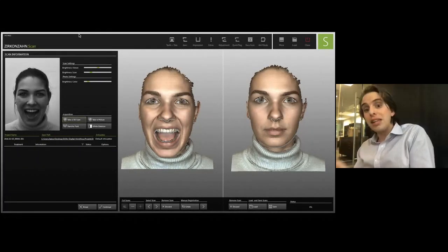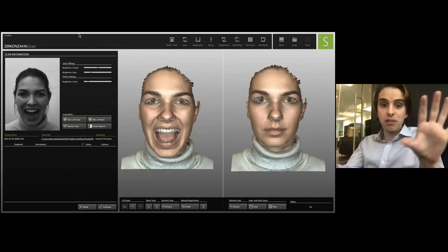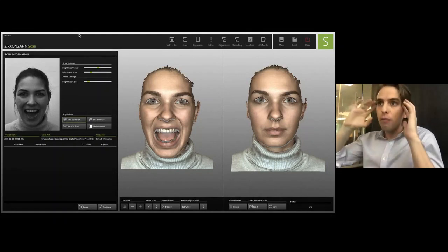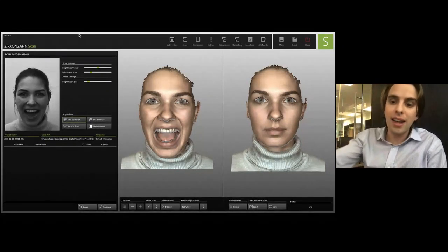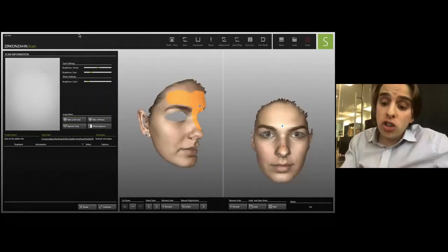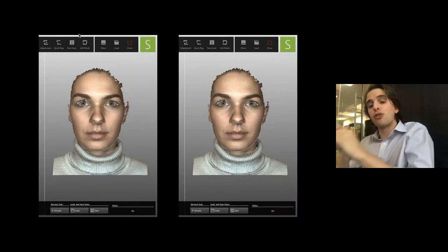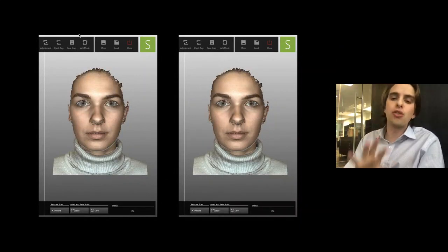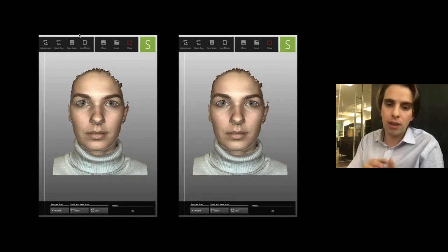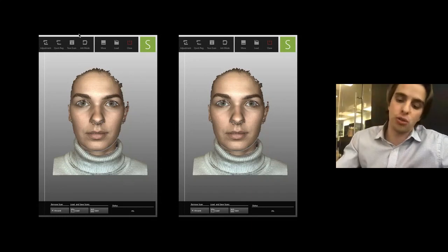So again, a theme from the first two courses where we have to take two items and match them together. So these concepts build on each other, but really the intent behind everything, we also need to strive to understand that we are merging this data together so that we can transfer the digital maxilla into a virtual articulator by means of references located on the maxilla itself, as well as the epidermis of the 3D facial scans.